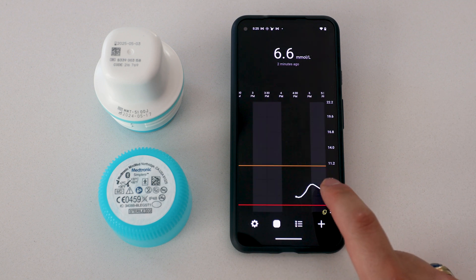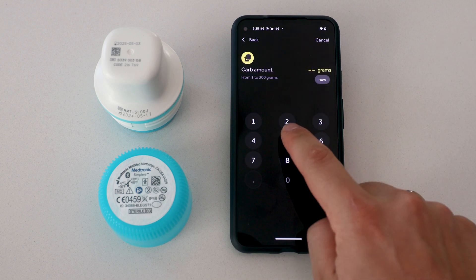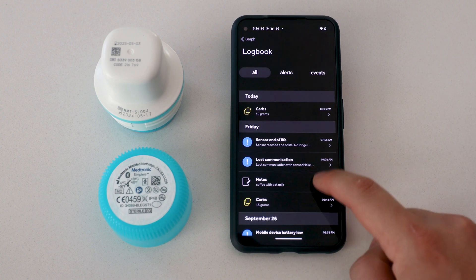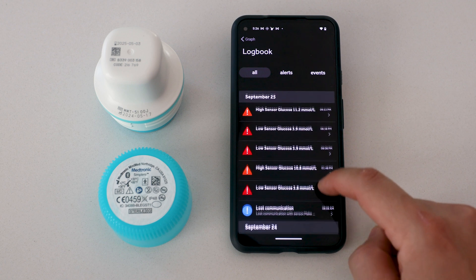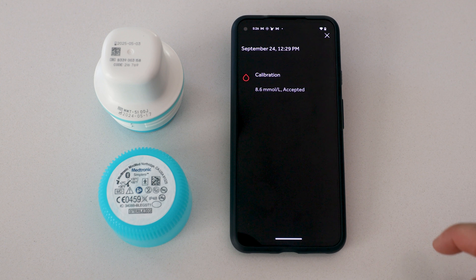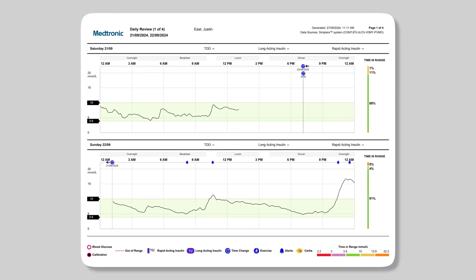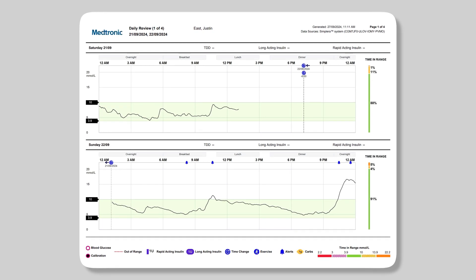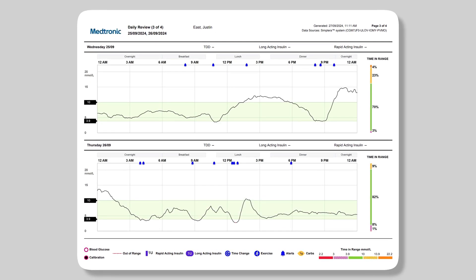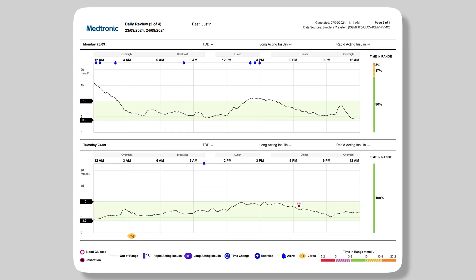Along the bottom there are a few tabs. There is a tab where you can log different events: carbs, blood glucose, long or short acting insulin, exercise, or a note. These entries show up on the app alongside all your levels, and you can tap them to see what that note was. This information will also show up on CareLink reports — it's kind of the Dexcom Clarity for Medtronic, where you can see all your data. If you want me to dive deeper into CareLink and what those reports look like, let me know in the comments.